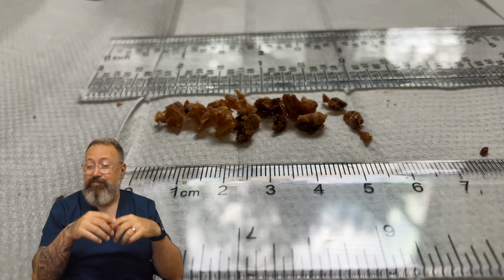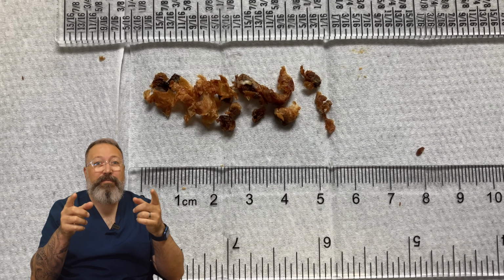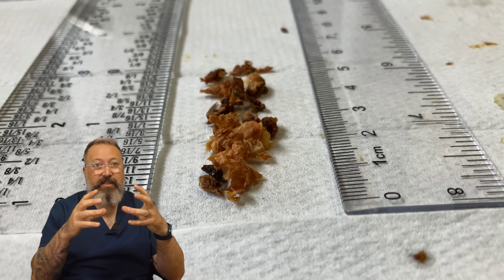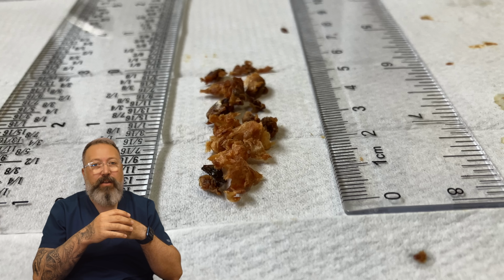Eardrum. Wow, look at that. I've bunched that up and double laid it. That's 6 centimeters worth of wax. That is just over 2 inches. And that is just all combined together. I haven't spread that. If I spread that out, that probably would have been twice as long. But yeah, I told you it was a good one, didn't I?